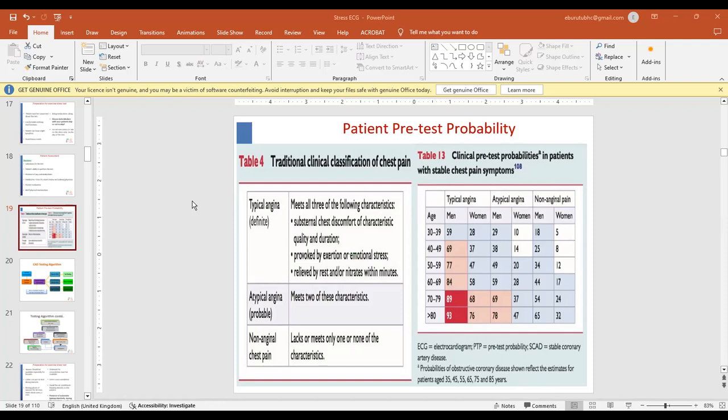Just to add, part of the precautions we take to ensure accuracy and safety of the test, apart from wearing comfortable clothing and shoes during the exercise, is to ensure that our patients stay well hydrated before the test. They have to inform the health provider if they are taking any other medication, because that may need to be temporarily stopped before the test. They should also avoid heavy meals and caffeine before the test, because these can affect the heart rate and blood pressure.